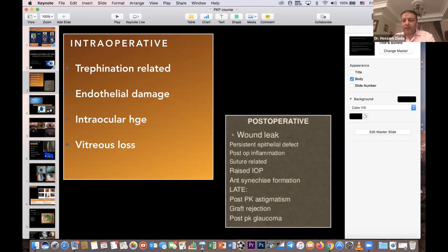Okay, Dr. Asad, do you have cases like that? Yes, I have one case like that. I remove the speculum and I make upper lid suture and lower lid suture. It's an alternative if you don't have the proper speculum for this situation. The upper and lower lid sutures will be a good alternative for that.